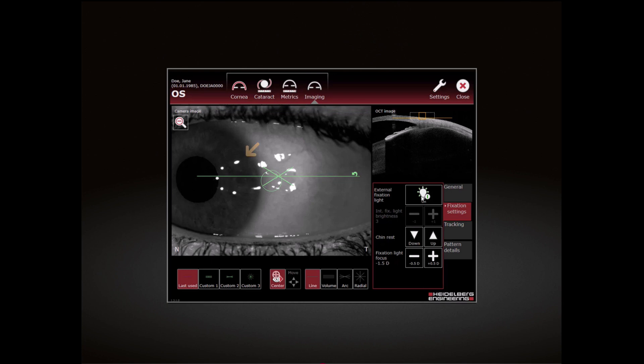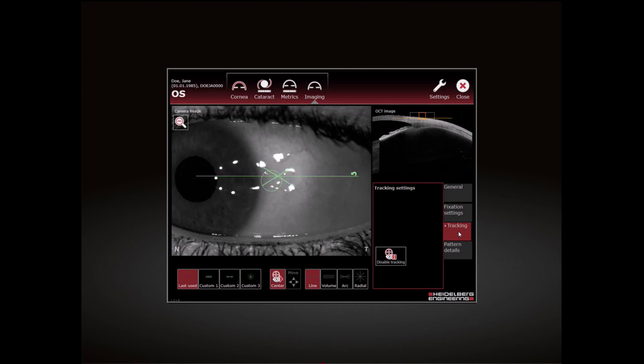How to disable: To switch off the tracking function, select the Tracking tab and click Disable Tracking.